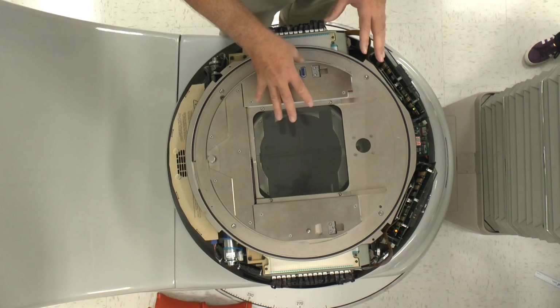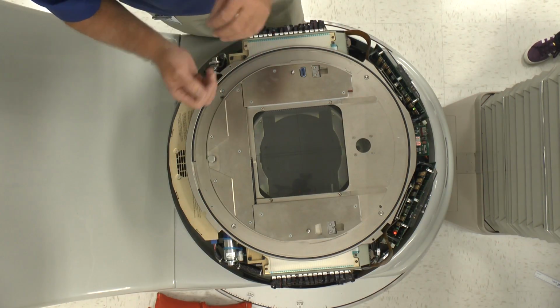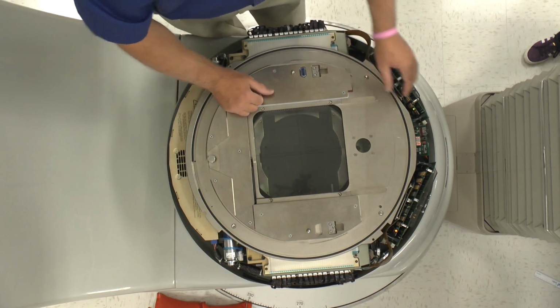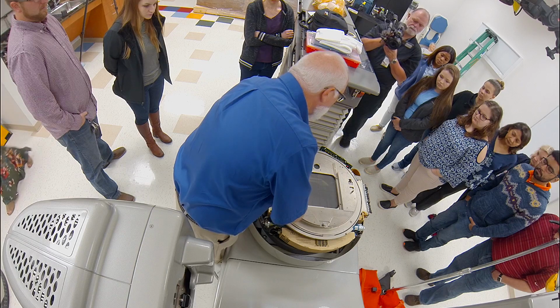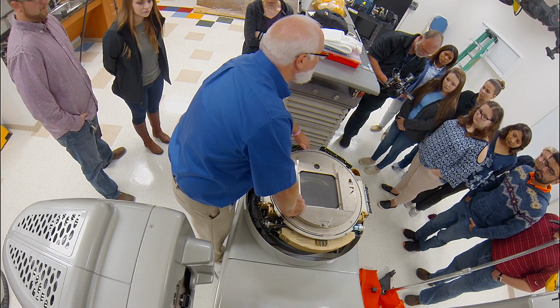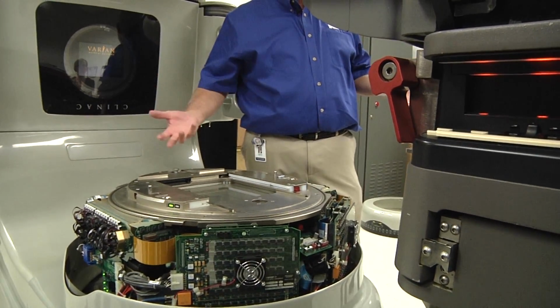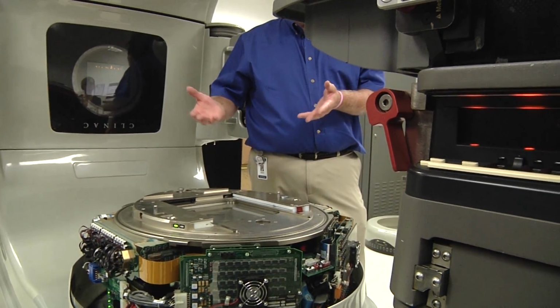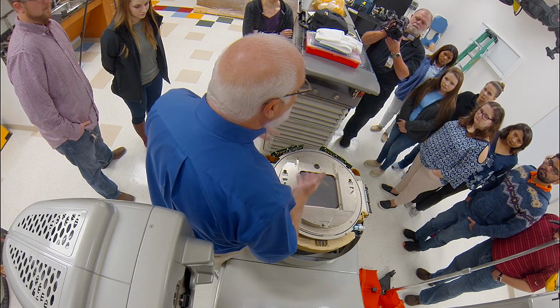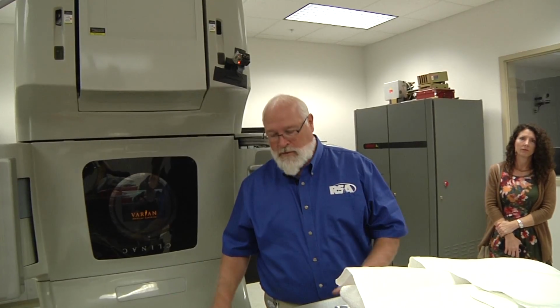So you might have a leaf that fails initialization. A lot of times it's sticky, or maybe there's some lint or a little bit of oil in between the leaves. So you'll come in and you'll move the leaf by itself, put it back to normal so your lights are off, and then you go reinitialize in the room. See if that fixed your problem. So that's maybe 5 minutes worth of work. You didn't really do anything, but you just saved yourself maybe 2 or 3 hours of downtime.